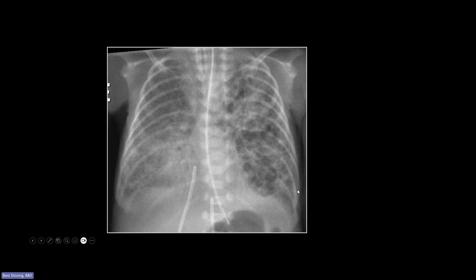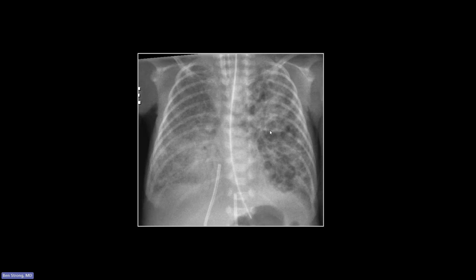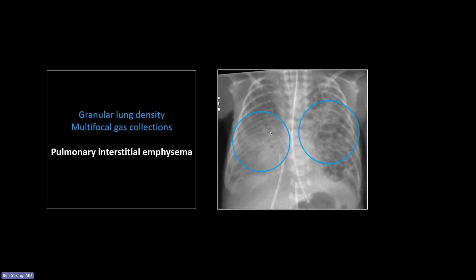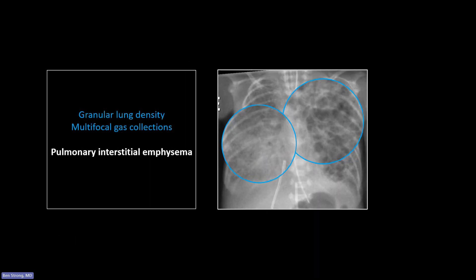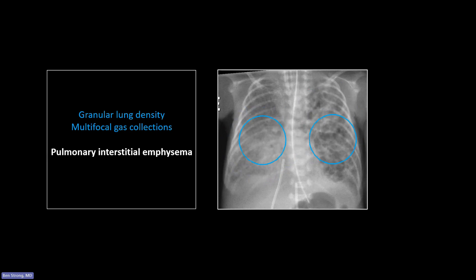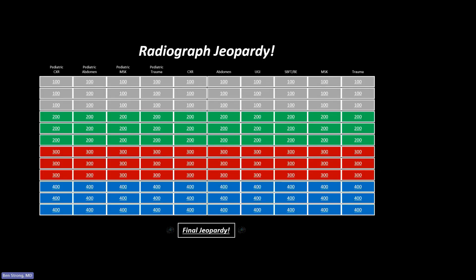PIE only happens in ventilated patients and is interstitial within the lung. The granularity on the right almost looks micronodular — what it is, is alveolar fluid. On the left lung, you've got those cystic gas collections in the pulmonary interstitial.